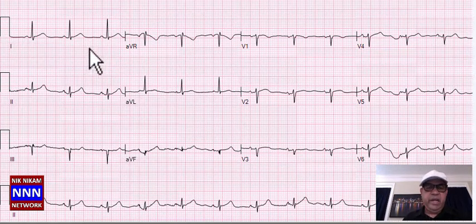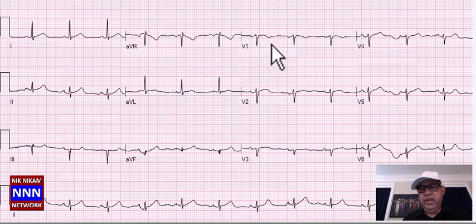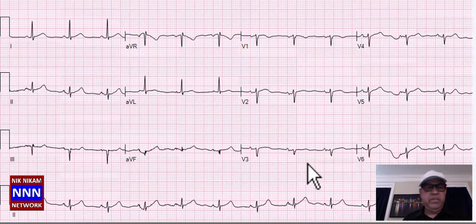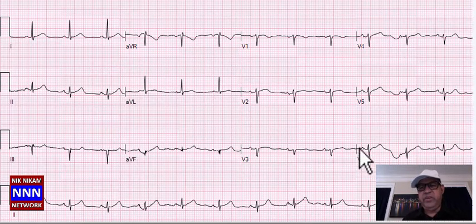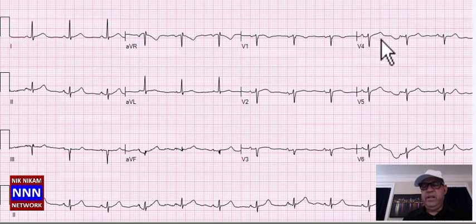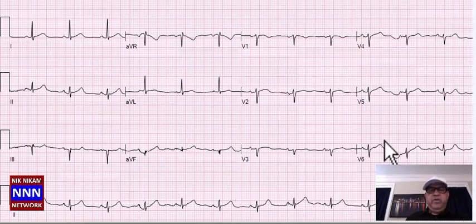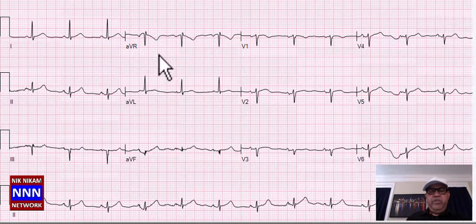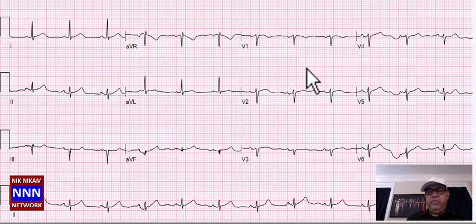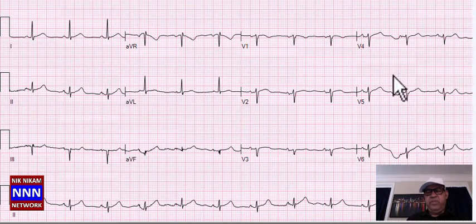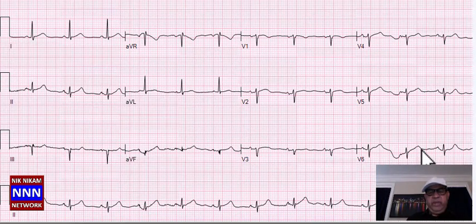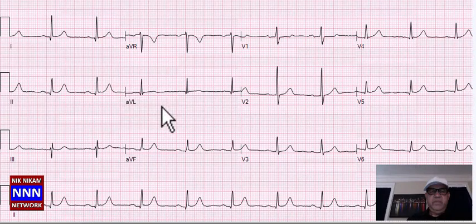Sinus rhythm, little low voltage in the anterior leads — this 67-year-old patient. R-wave progression in the lateral leads is not up to par. I would be concerned about a patient with sinus rhythm, possible old anteroseptal infarction, and non-specific ST-T changes.